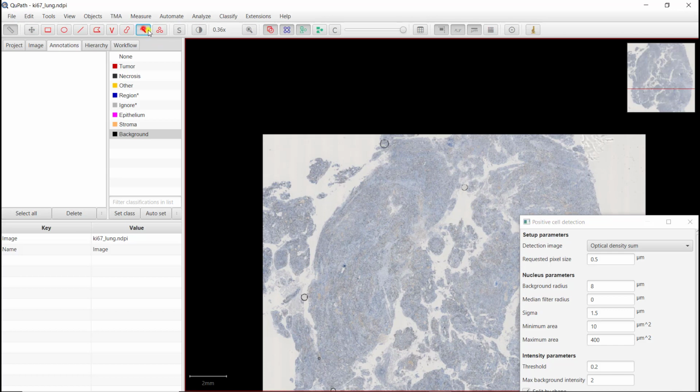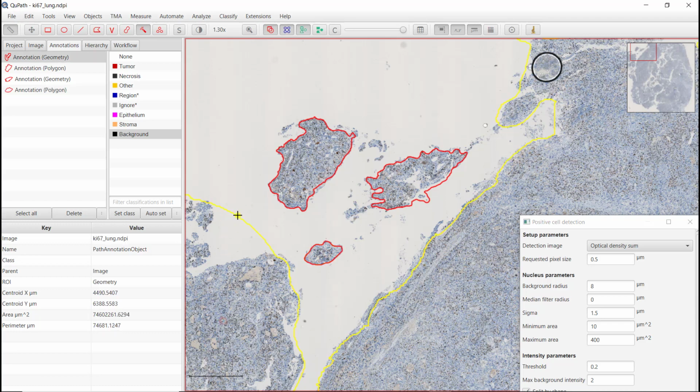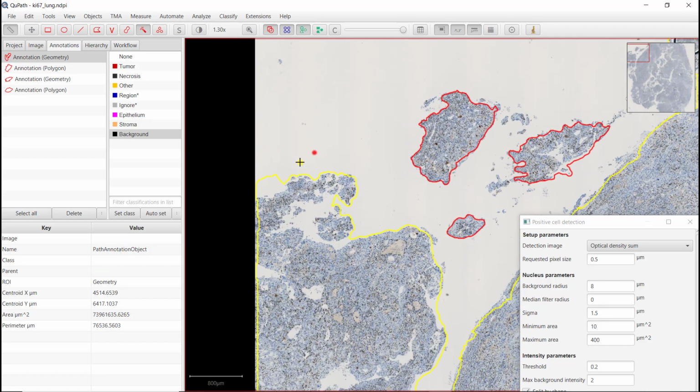So you can use the wand when you are at this resolution. That's a pretty nice tool. You need to find the right resolution. So here it's not great. It's okay. I'm going to just remove them later on. So let's say it's fine. I want to go back here. If I use the Alt key, I can do probably something better like this. All right.